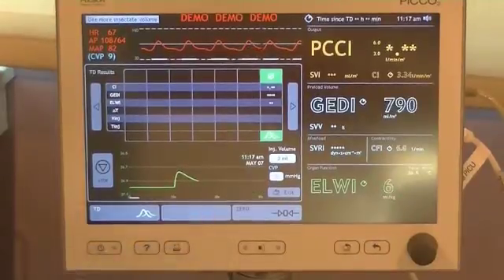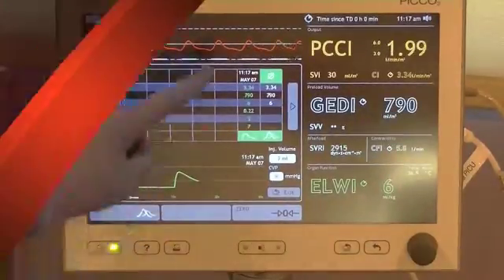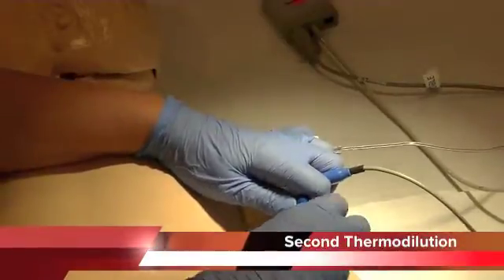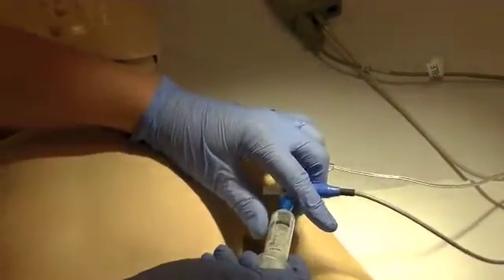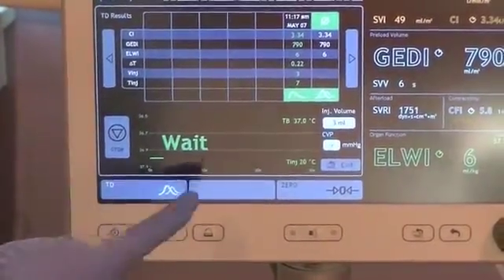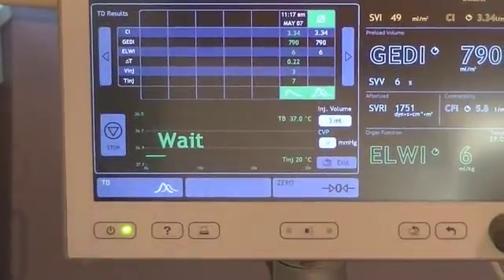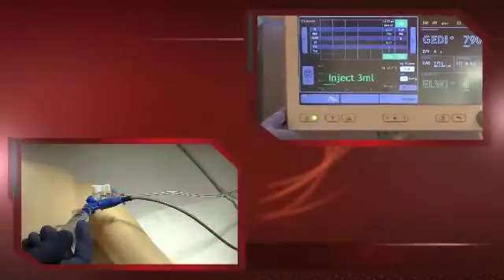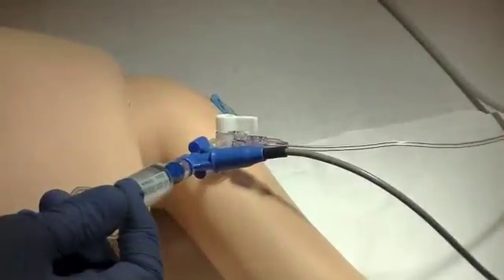This process needs to be repeated two more times. Connect the second normal saline syringe to the end port of the CVL. Now, press the Start key. When given the cue, push the normal saline in a swift and steady fashion, no more than seven seconds.